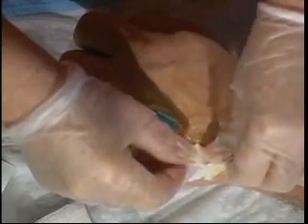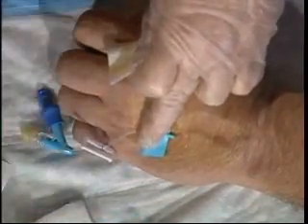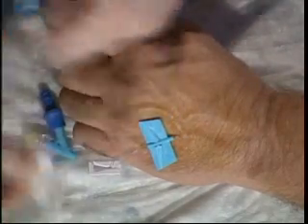And tearing of the hair. Some of our patients who are particularly hairy have a lot of hair on the extremity. When you remove the tapes, if you roll the tapes to the outside of the arm versus pulling them on the inside, you won't rip the hair and cause a lot of discomfort to the patient. So again, just using the alcohol to dissolve the adhesive will help removal of the dressing material. Always keep your finger or your hand on the stabilizing wings or on the catheter adapter so it doesn't move around in the patient's vein.